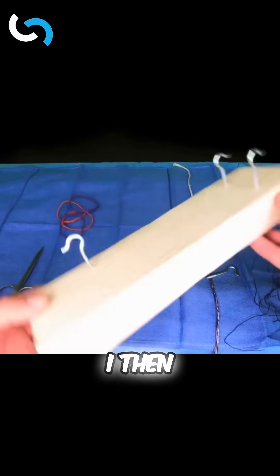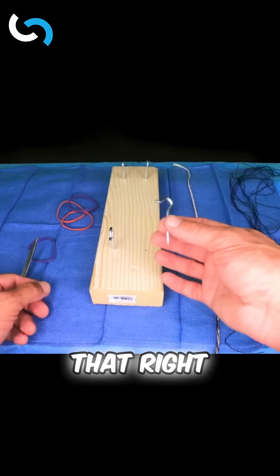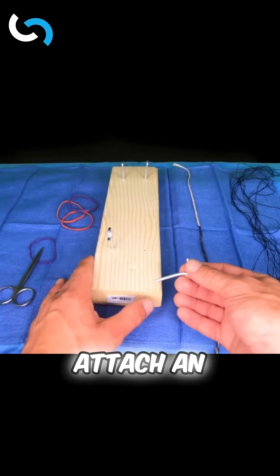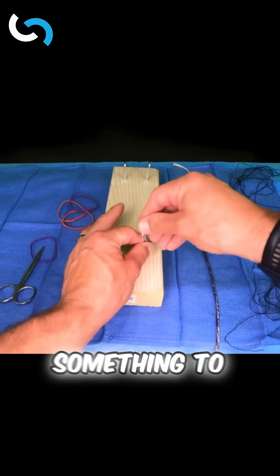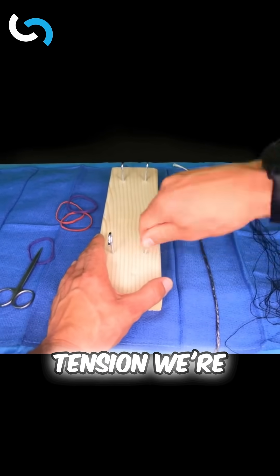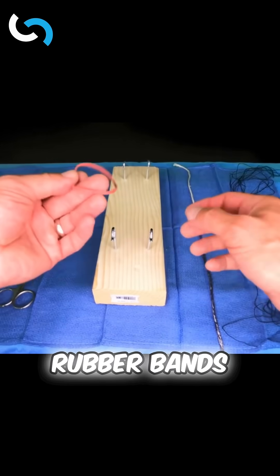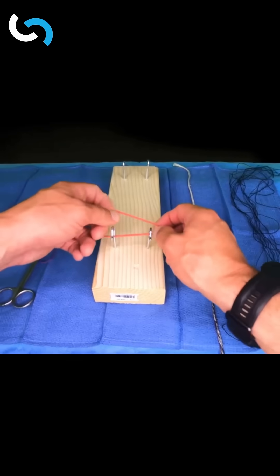I got a two by four, and I picked up some screw-in hooks — you can see that right here. This is going to allow us to attach an industrial rubber band so that we can have something to get a suture down on that mimics the type of tension we're going to see in the body.